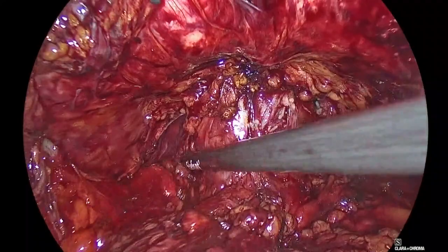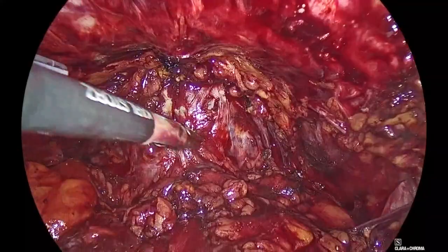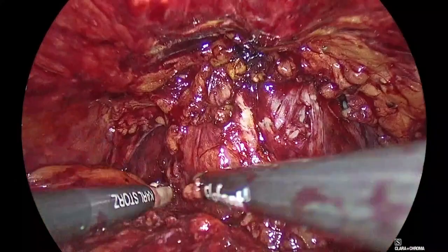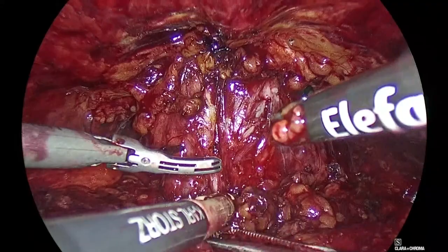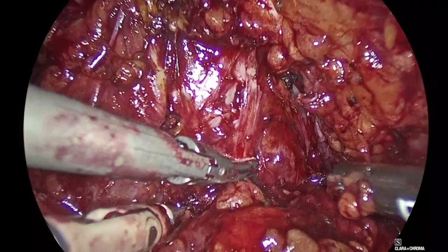You see this on the left? It makes no sense to mobilize more on the part where the mesh is because there is no space and you can really damage structures. So we go on the bladder neck. Prostate comes around here and around here. You see how this is overlapping up here? So Padeli, rotate Padeli to the right. To the right, Padeli. Correct. So we start on the prostate. It overlaps. Come closer, Padeli. Harmonic scalpel on my left hand, bipolar on my right hand. No monopolar energy.